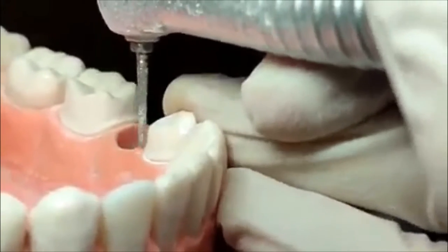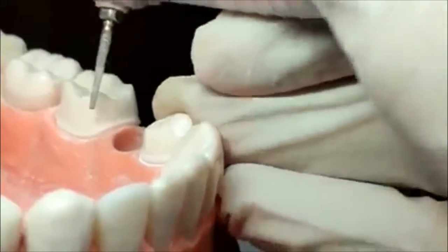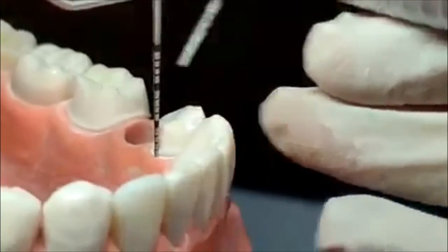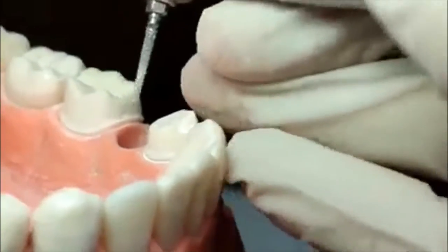Dito sa view na to, you can see na half of the burr went in all throughout. Kasi nga natin kung height niya ba is sana at least 0.5mm. So, hindi na mataas pa, let us move it down.